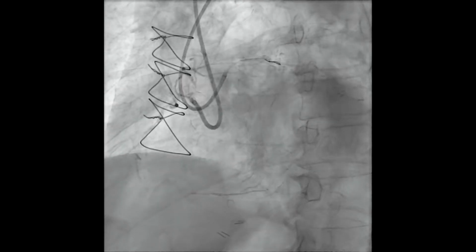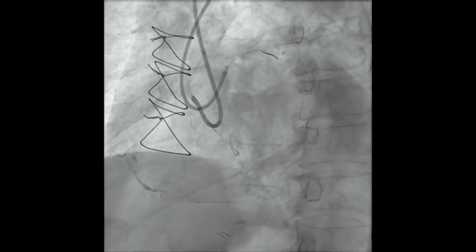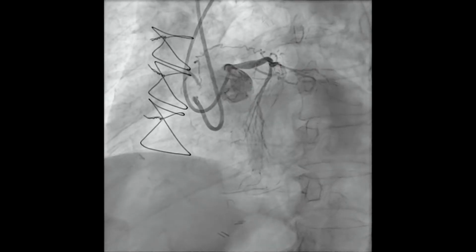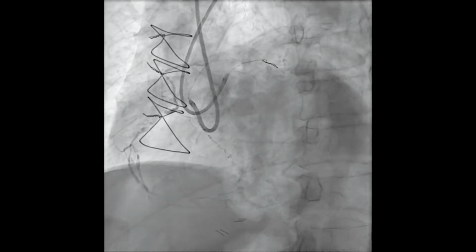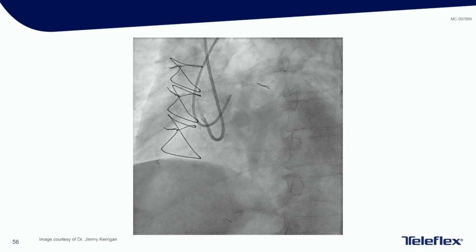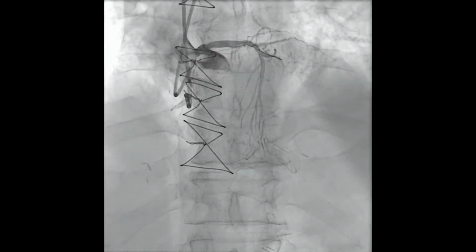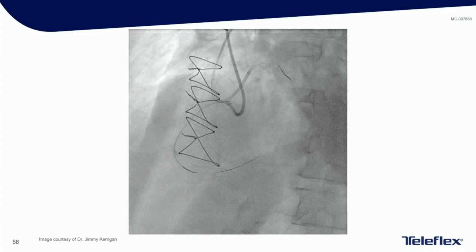This next case is something a little bit different. Again, you'll see that we're biradial, 48-year-old guy. A lot of young patients, unfortunately, come to see us and had a history of bypass with a failed vein to the right, a patent vein to an RPL, and a CTO of the distal right. So in this case, it looked like we had an antegrade channel. So we set up antegrade, went to move forward, and noted, though, that there was a septal arcade if we needed to go retrograde in this case.